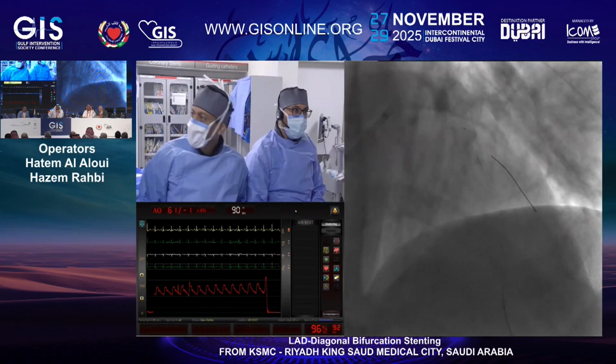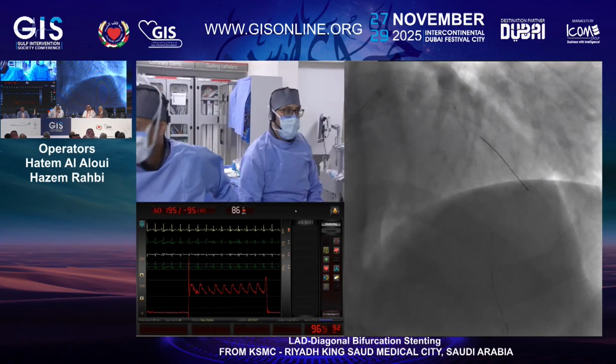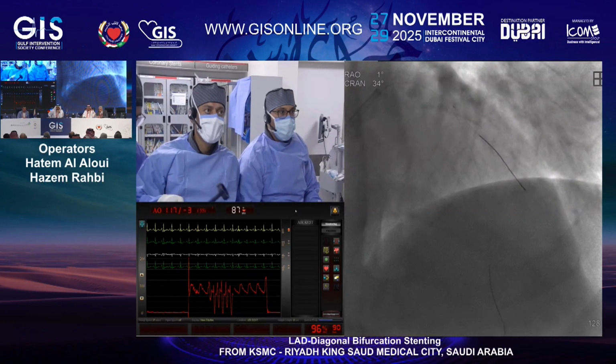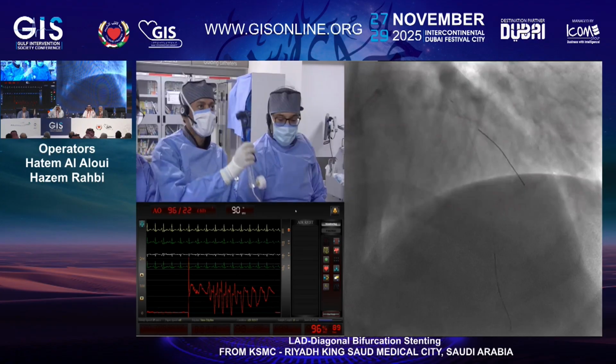So here you prepare that part very well. I think it will be more compliant, and we will have less risk of carina shifting. There is a question from one of the panelists: why use cutting here?